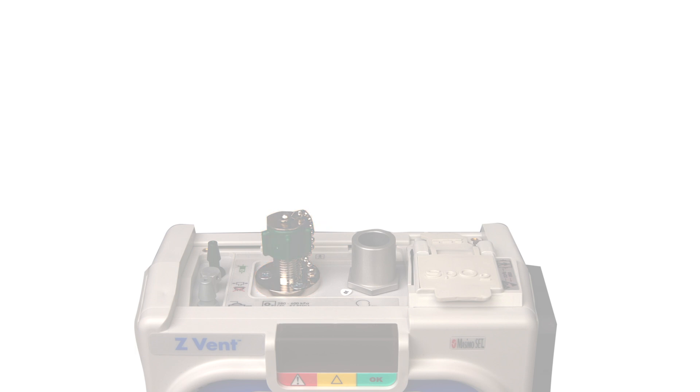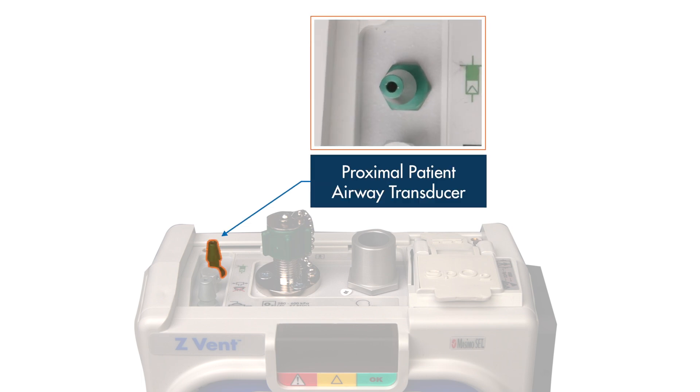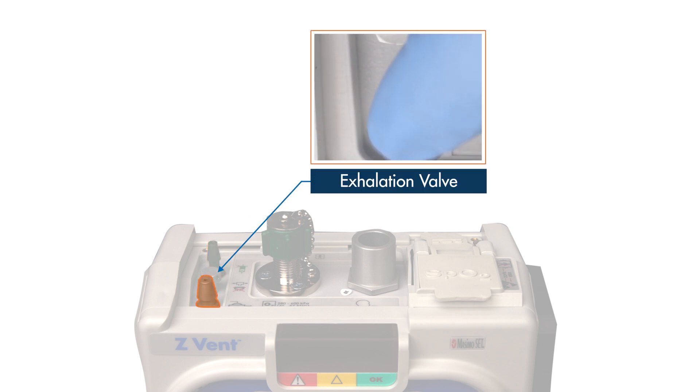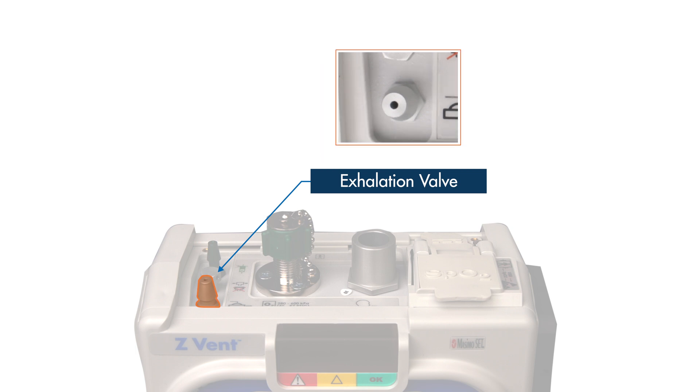Along the left side is a row of three ports. The green nozzle at the top left is the patient airway pressure transducer for the patient circuit. The transducer automatically measures airway pressure within the circuit. The silver nozzle at the bottom left is the exhalation valve port for the patient circuit. The Z-VENT pneumatically controls the exhalation valve to open or close during inspiration and exhalation or in the event of an alarm.